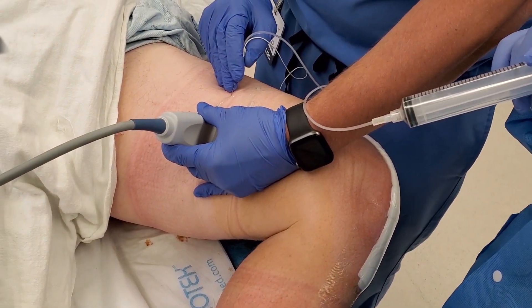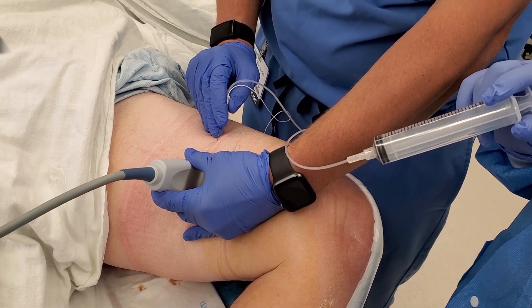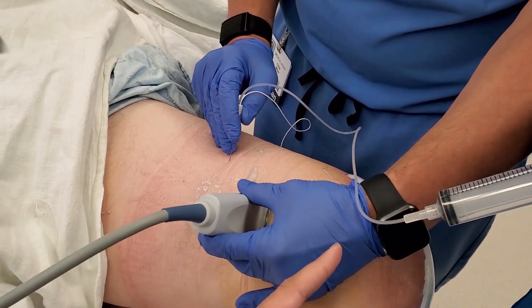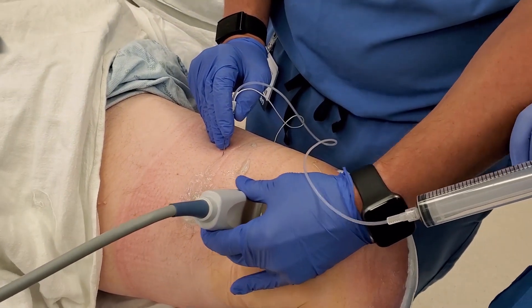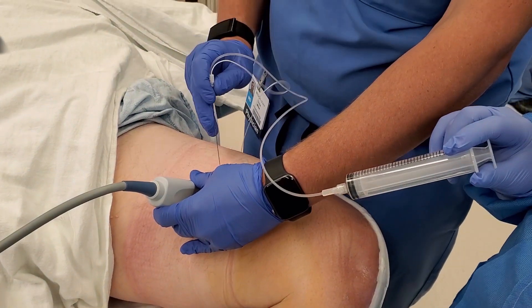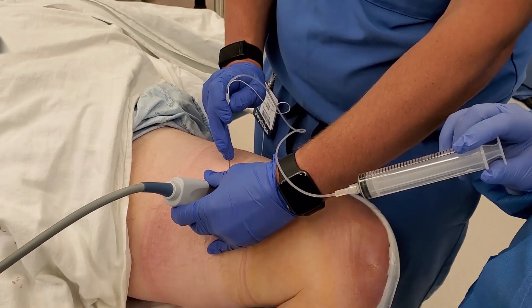His next case is going to be an ankle, and he may do an adductor block for that, but the point of that will be to get the saphenous nerve, so that will be done more distally — perhaps down here somewhere. For knee cases, we like to go a little bit more proximal to increase the chances of hitting the nerve to vastus medialis, which also runs in the adductor canal.